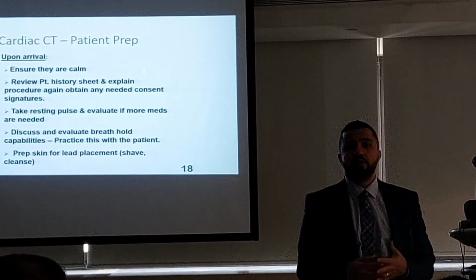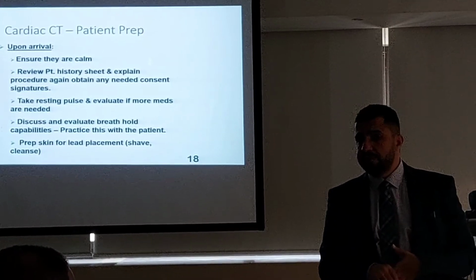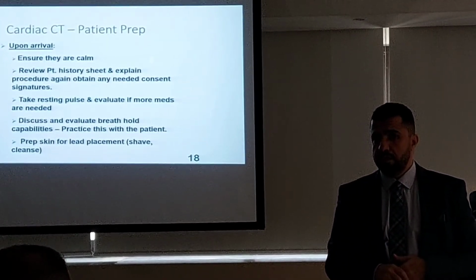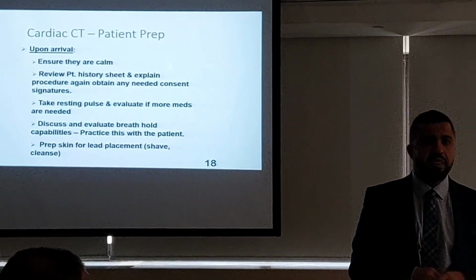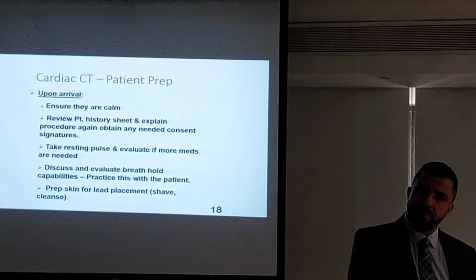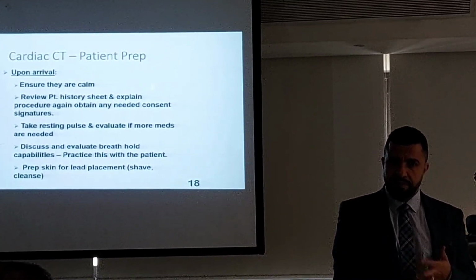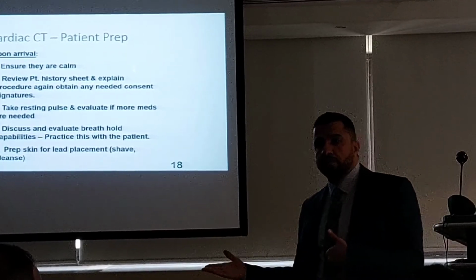So, you know the things. Communicate. But it's not like a regular procedure. This is much more. Explain to him what you are doing, why you are doing it, if he is really willing to know, and what you need him to do inside.